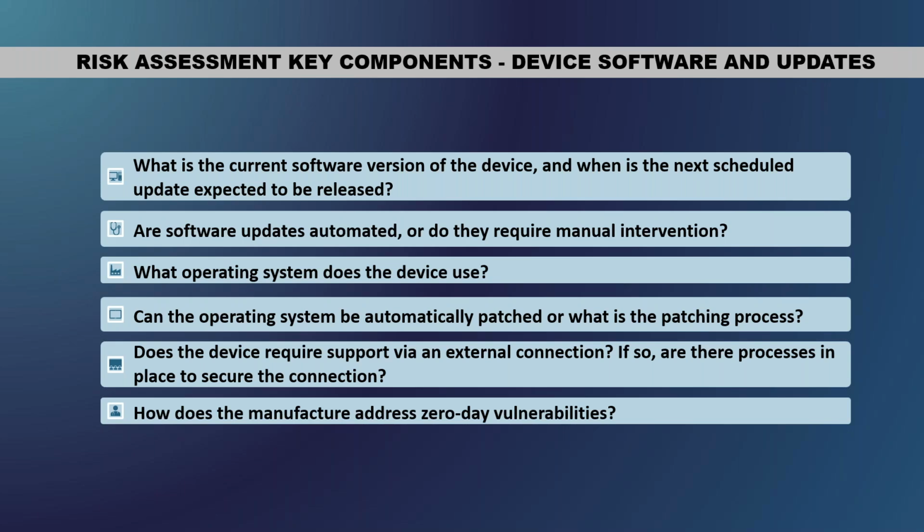The operating system. So you all know that we're all trying to minimize the unsupported operating systems that we're procuring in the healthcare environment. Now, a lot of medical systems, unfortunately, cannot move to Windows 11, the latest and greatest operating system. That's going to be a problem. If they cannot, that shouldn't be a reason not to procure it, but that just identifies that you need to start tracking it and continuously monitoring the system more.